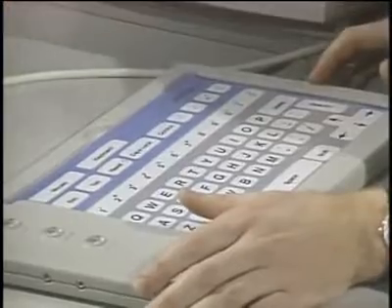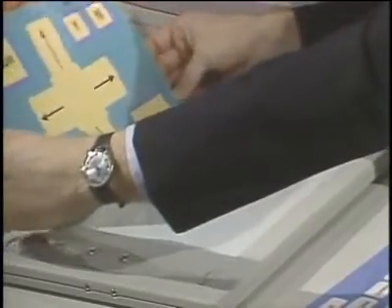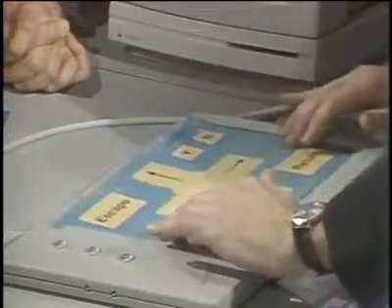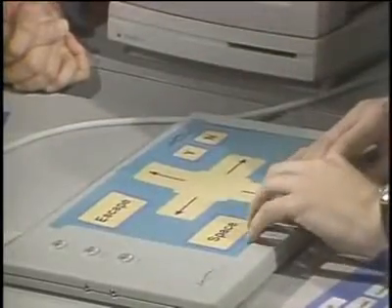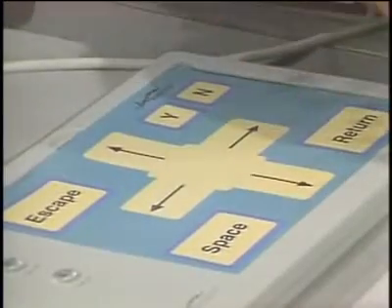And what are these other overlays here, Gary? Well, that's where the smarts of the keyboard comes in. On the back of each one of these overlays, there's a little strip that tells the keyboard what overlay it has in. So if you were to put this one in, for example, it knows what's in it. It knows it's getting a keyboard that has larger spaces in it and different keys. And what kind of user would use something like that overlay? A person that would, again, be using a hand stick or a head stick or a mouth pointer, or just need a few keys to operate the software.